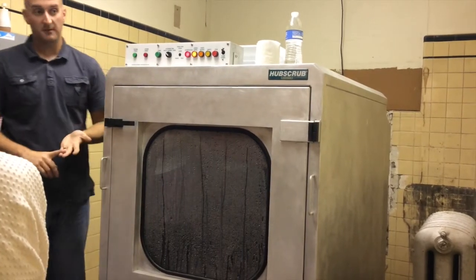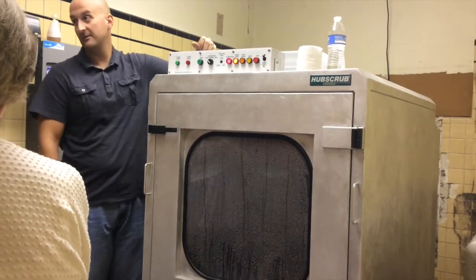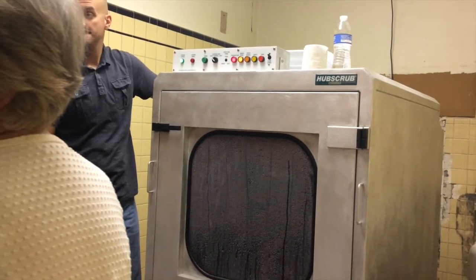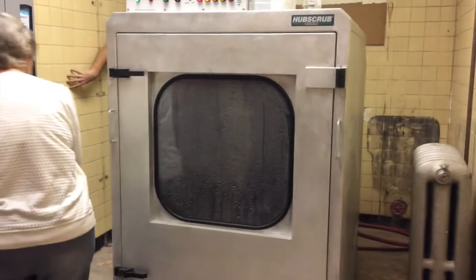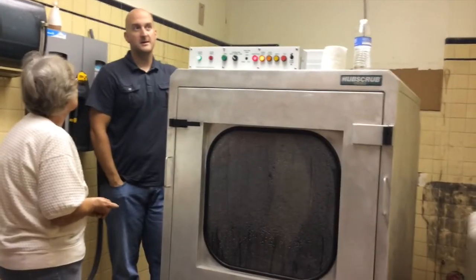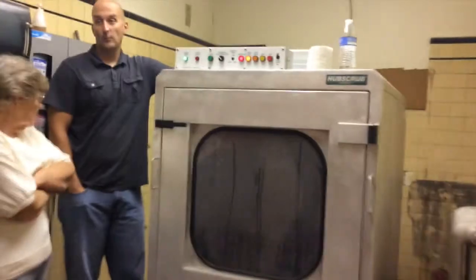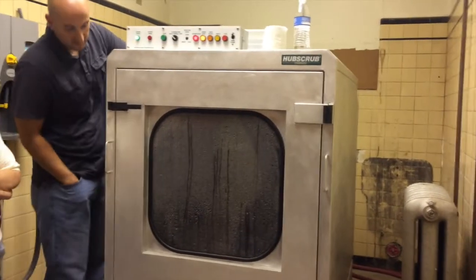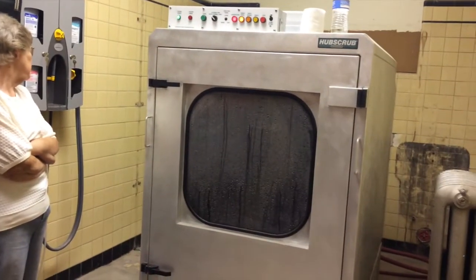Any time you put canes, crutches, walkers — anything with adjustable legs — if they've been sitting for a while and then you pull that leg out, rust and water is going to pour out of it. I've got a question about the drain — do you need a floor drain for this? This one actually goes into your floor drain. Ours at the center goes in the wall, just like a washer and dryer. It goes into the septic tank just like all the other drains in the building. There's nothing in here that has to be accounted for as a hazardous material.